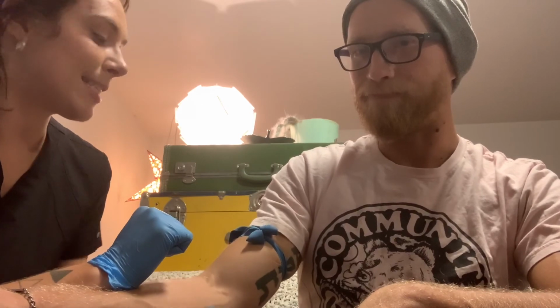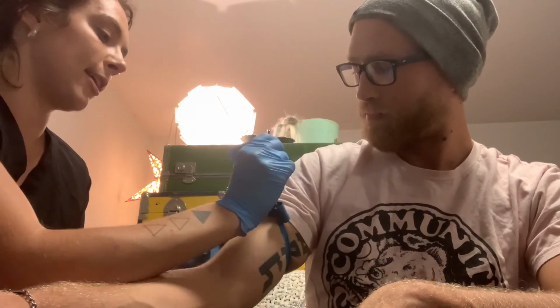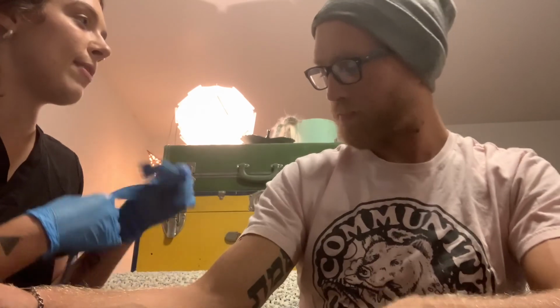And we are done assessing the vein at this point, and I would take the tourniquet off and continue with my IV preparation.